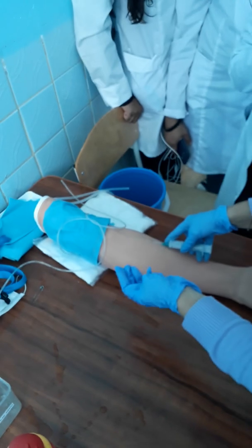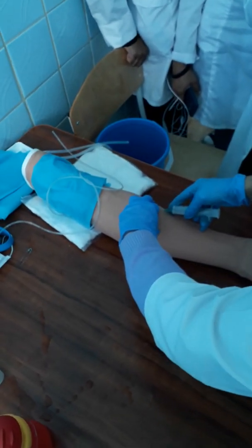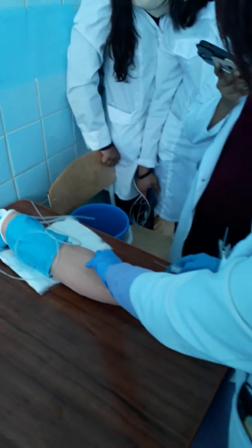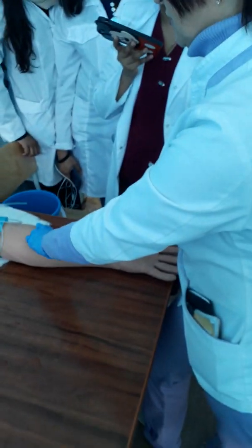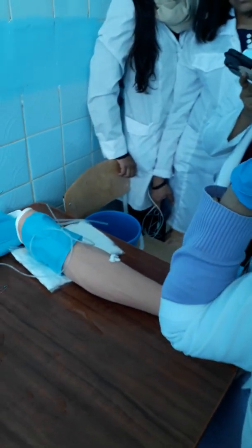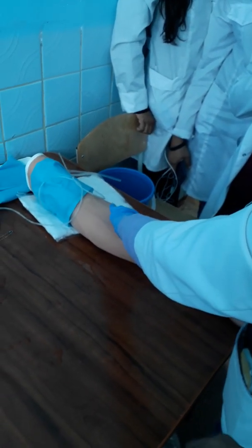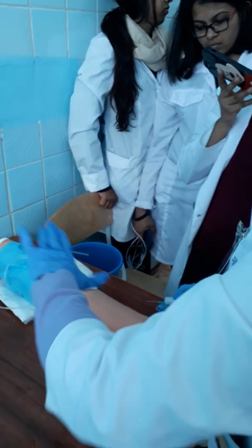You stop before, and after that you press this swab on the skin near the needle, remove the needle. How are you? What do you feel? Continue to communicate with your patient. And if it's ulnar venous, you can ask your patient, please bend your arm and hold this swab in this position. Only you must take it. If your patient doesn't do it, you must press it. You can use a roll of bandage if you see the bleeding continues.